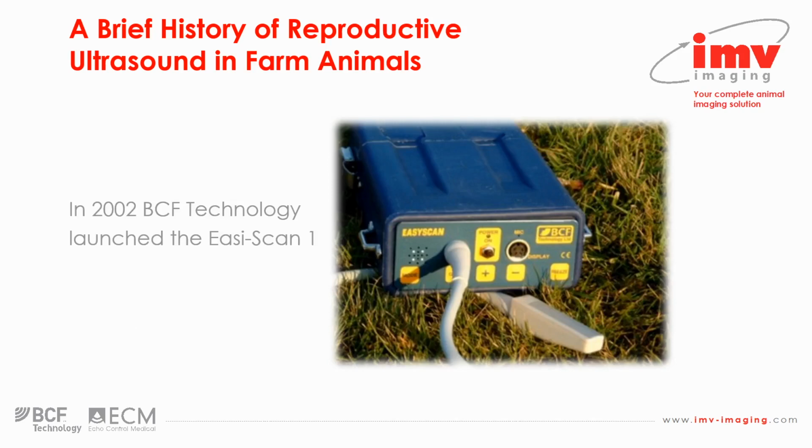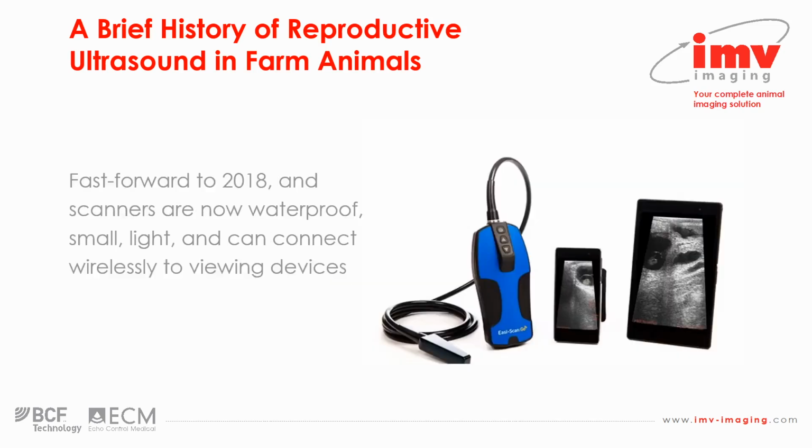As a company, IMV used to trade as BCF Technology, and BCF Technology in 2002 produced the EasyScan 1. So we can see here in this picture, this is one of the first portable on-farm units that was ruggedized to work reliably in the on-farm environment.